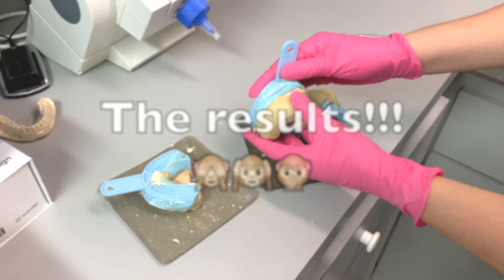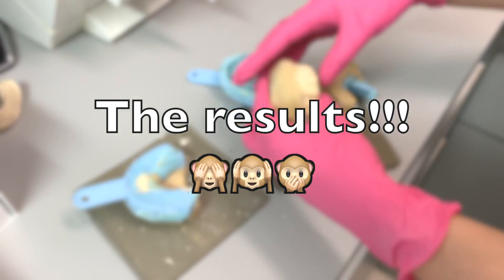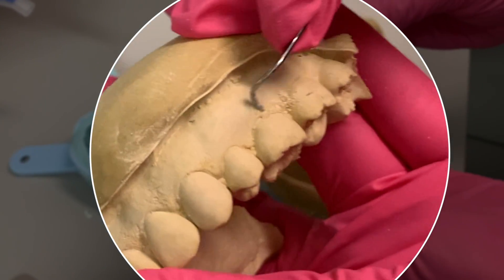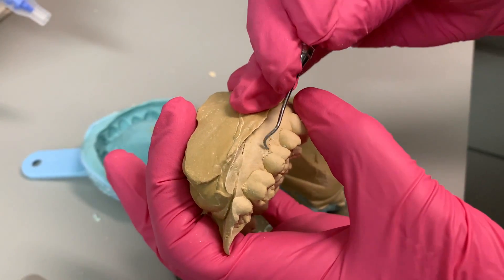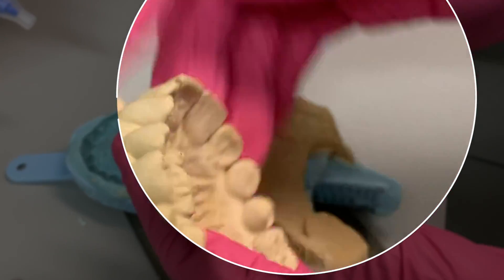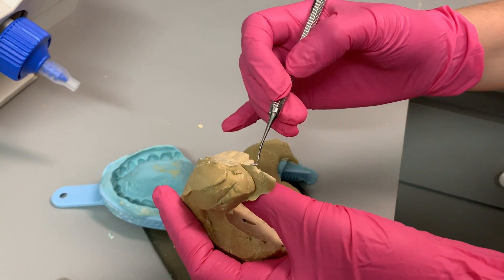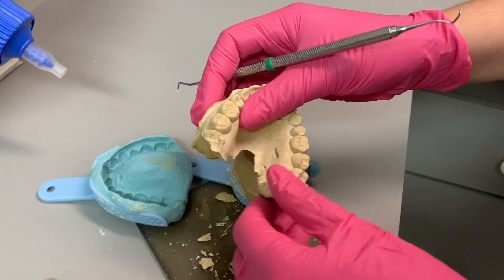Okay, so we're going to separate the models. This is the upper one. You see there are some bubbles here, which for a bleaching tray is fine — you can just carve it out. There's a tiny void there, but again, for a bleaching tray it's fine. You're going to see the wisdom tooth here. For a bleaching tray it's completely fine. If it was for a night guard or a retainer, then that would be a problem. But we can cut that off — it's no big deal.